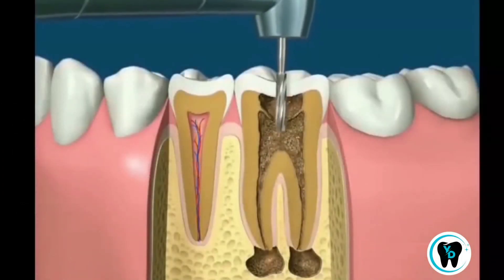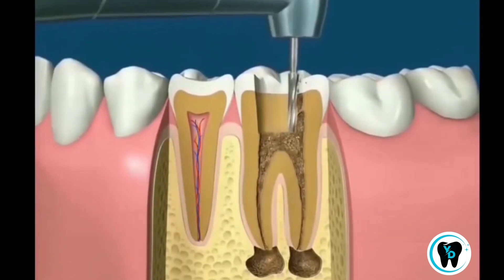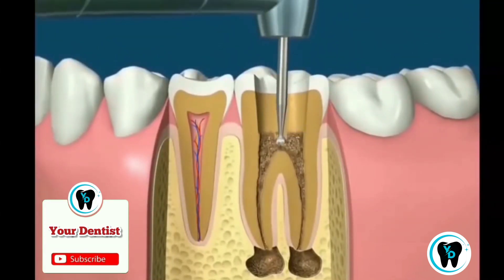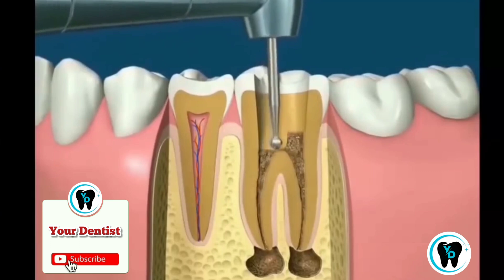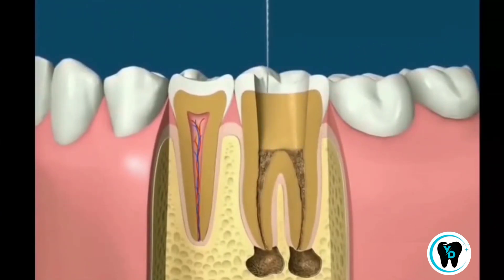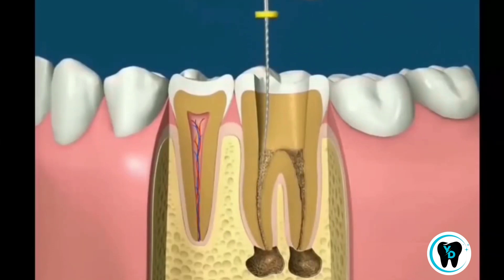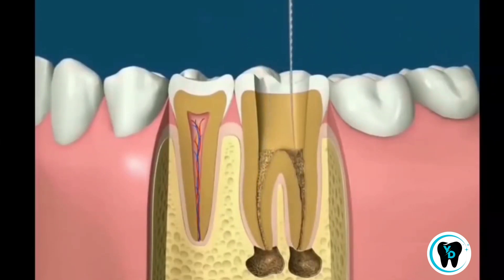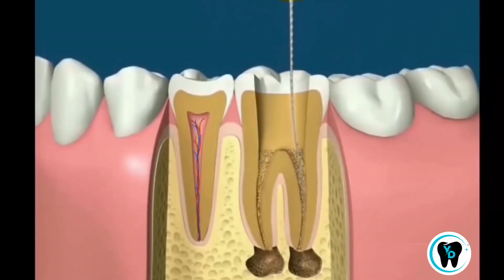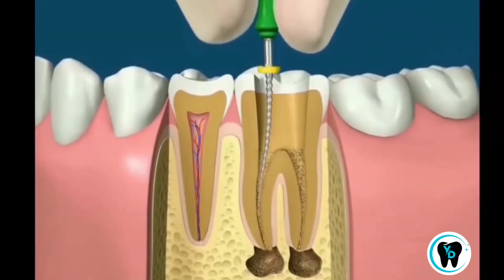Root canal treatment begins with a standard drill to access the inside of the tooth. Slower speed round drills can then be used to remove decay and to expose the canals. Tiny files are then used to remove the contents of these canals. The manual method of root canal treatment involves using increasing file sizes that gently clean and shape these canals.